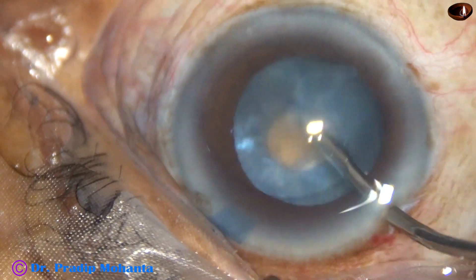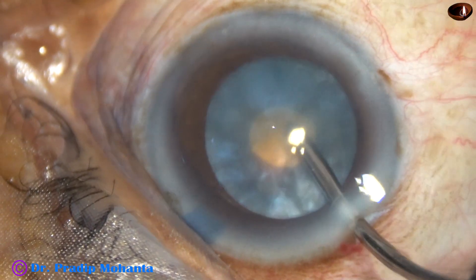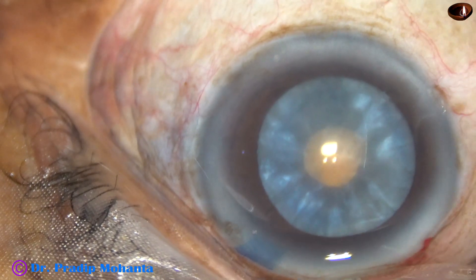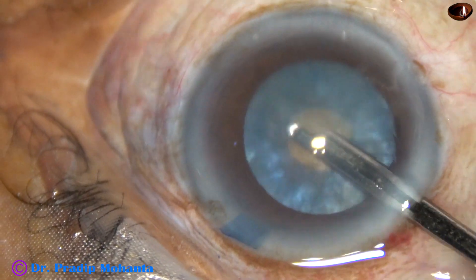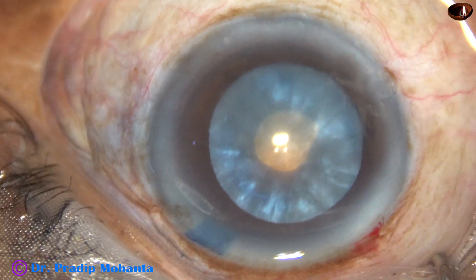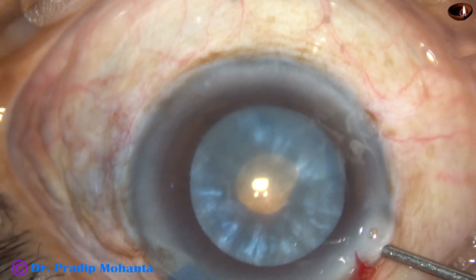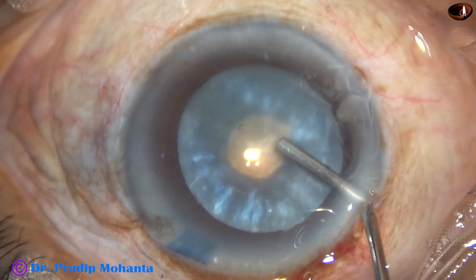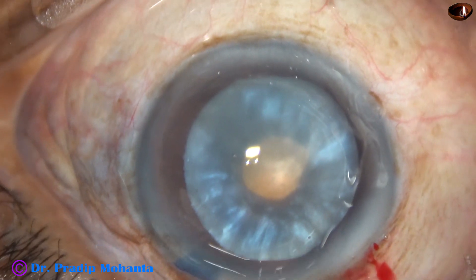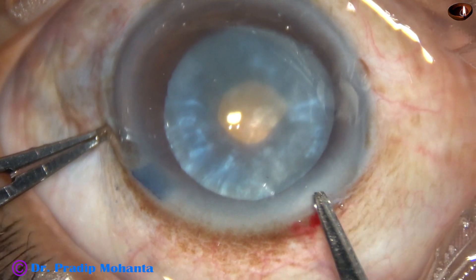Once the intra-lenticular pressure is reduced, the enlargement of this small rhexis will be very easy. A lot of cortical matter has come out. Now, 2% hydroxypropyl methylcellulose is injected into the anterior chamber. This is 2% HPMC applied over the cornea — visibility improves a lot if we apply this.